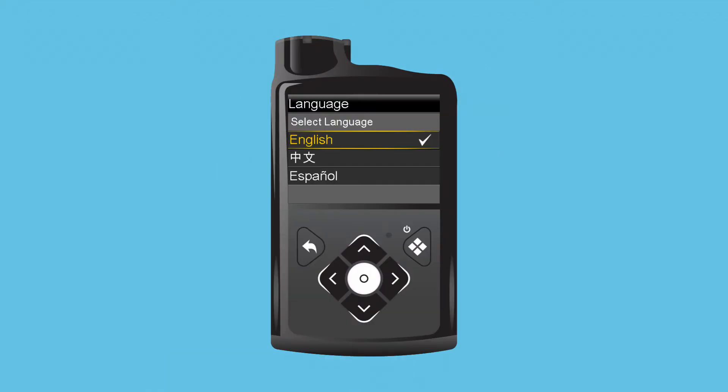The first screen of the startup wizard is language. Clara makes sure English is highlighted in yellow and presses Select. Next, she needs to choose the time format. She wants the time in a 12-hour format, a.m./p.m., so she presses Select again.